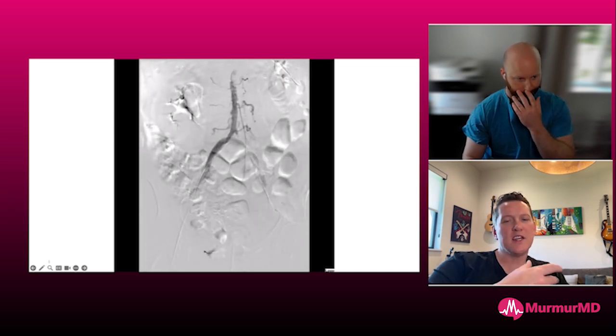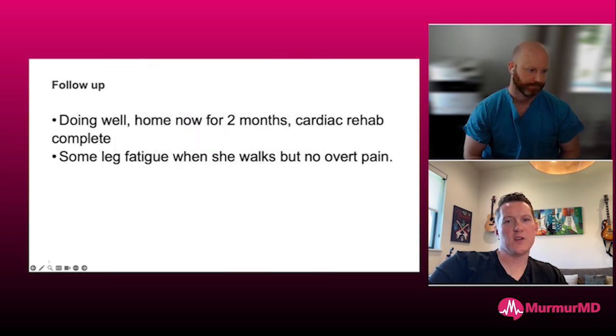I know some people take an angiogram through the Impella sheath just to make sure the iliacs are okay, but that's super elegant. And Chris, when do you give protamine? I know we'll talk about this maybe a little later. At what point in the closure process? I give protamine after the Impella is explanted because I don't want it to clot. But as soon as the Impella is explanted, we deliver protamine. We give sort of a medium dose, between 30 and 50.